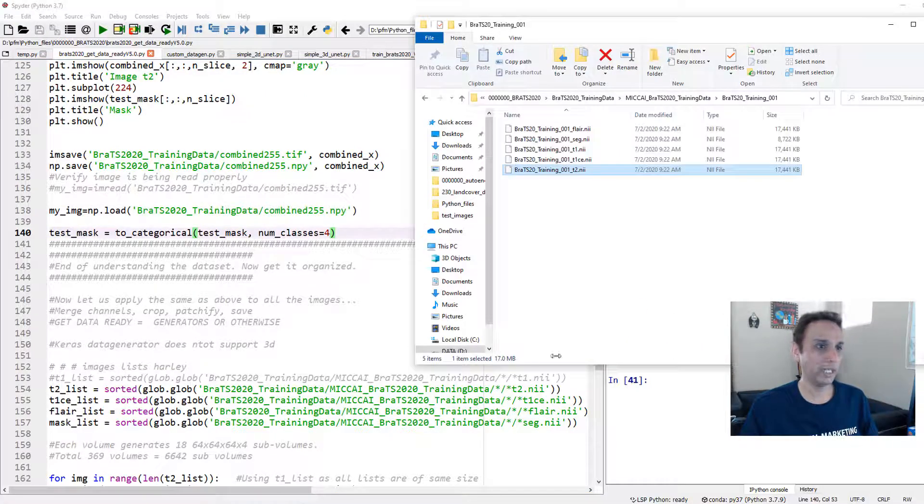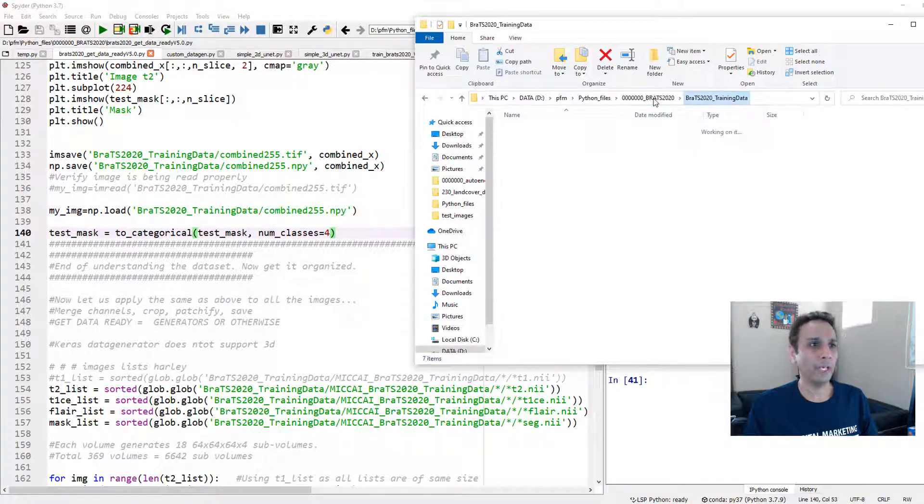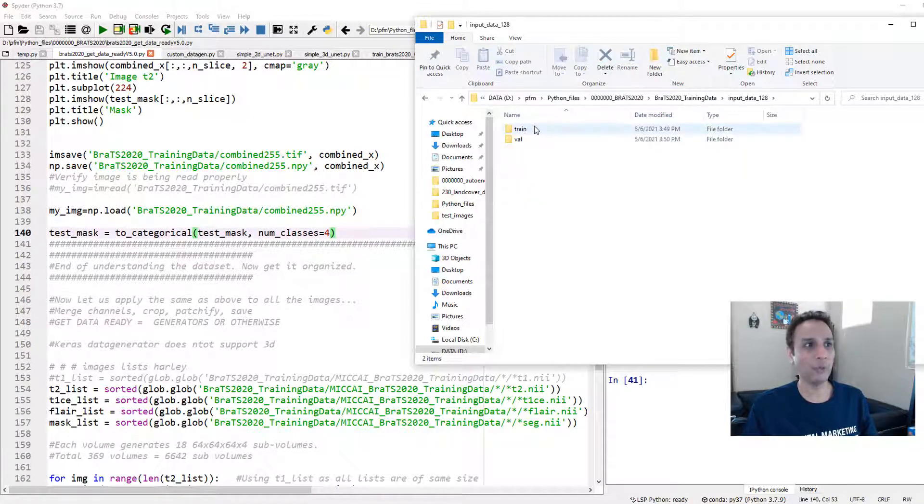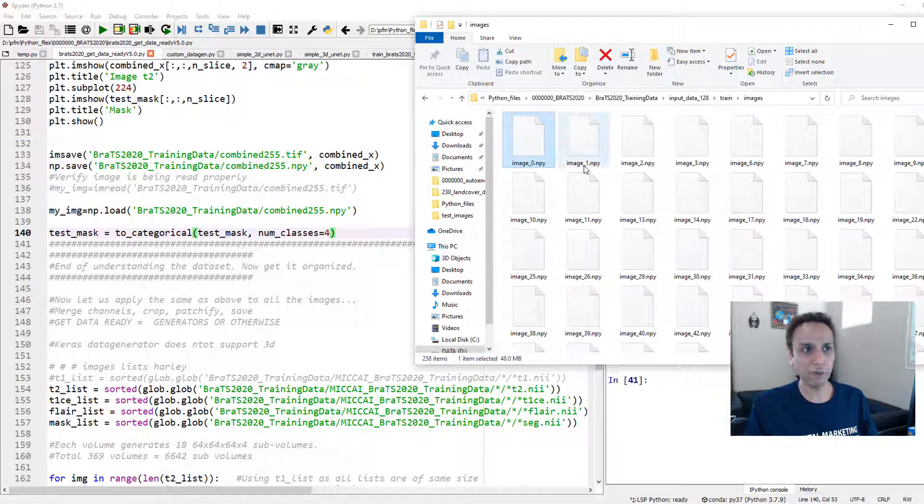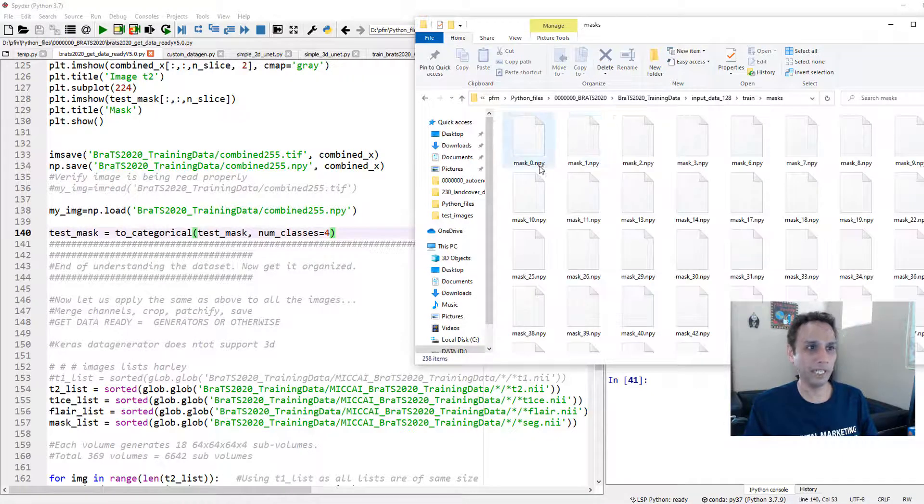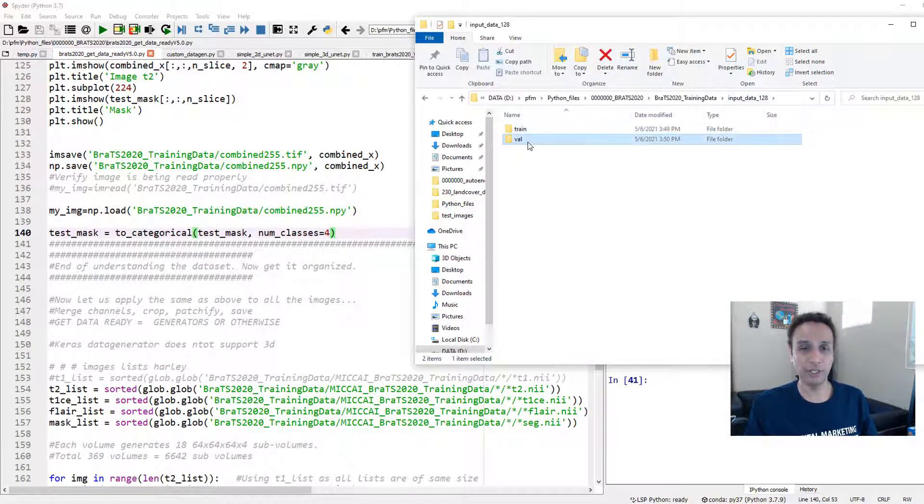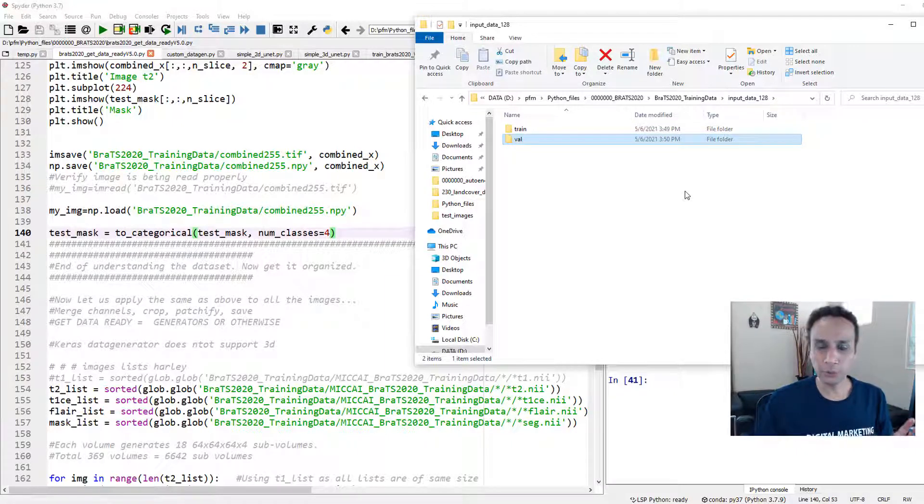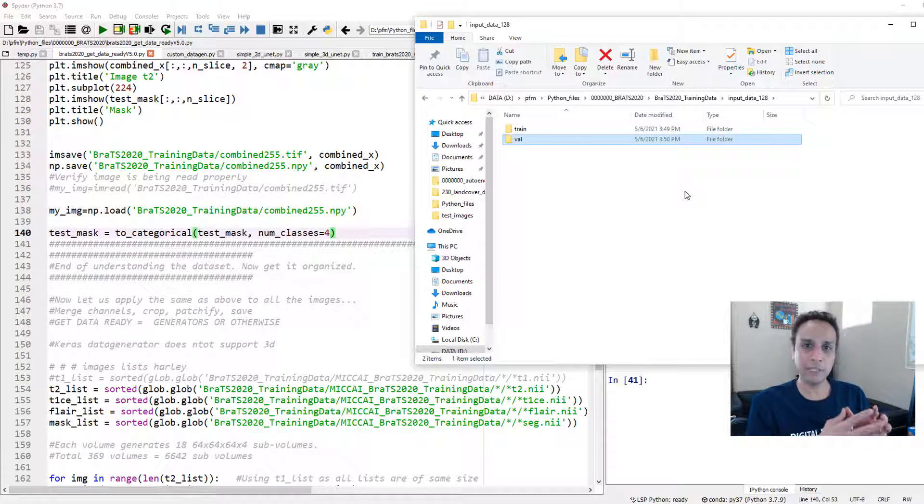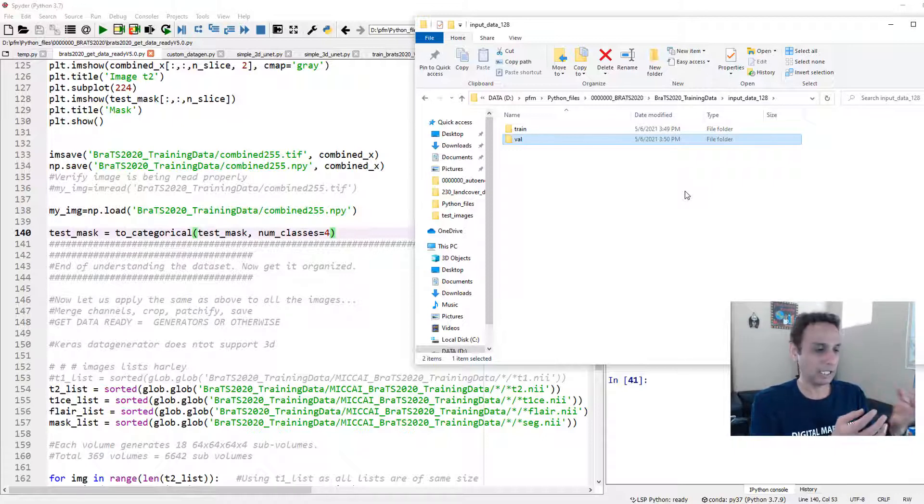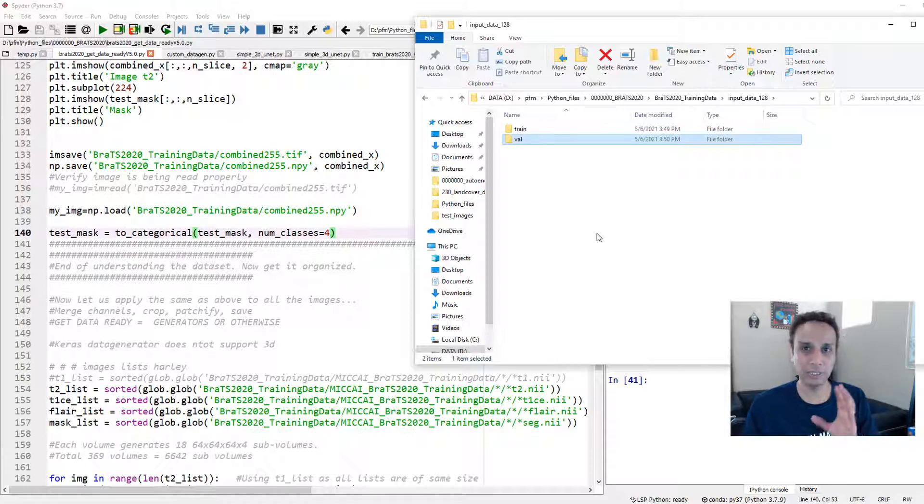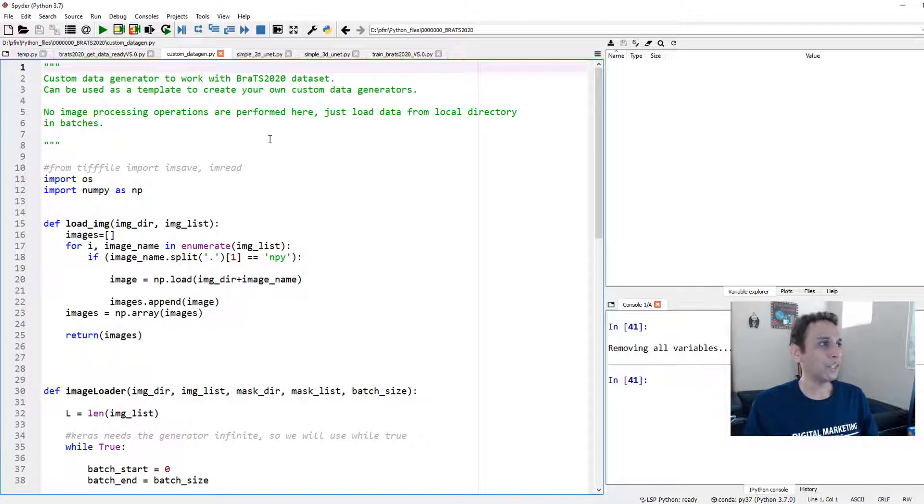Once you do that, we cropped both my input values like X and also the mask into sub-volumes of 128 by 128 by 128. By that way, we are minimizing the area that's outside the actual volume and also fitting them to a number that's convenient for us to work with. We saved all of those as NPY files, which is nothing but a NumPy array, so we can load them from disk later on.